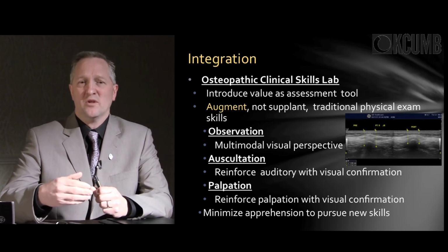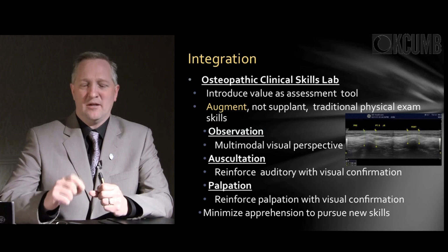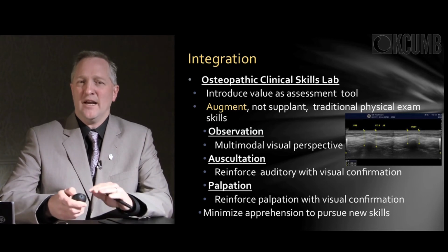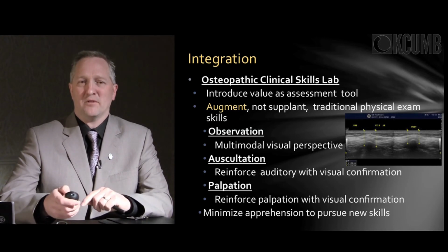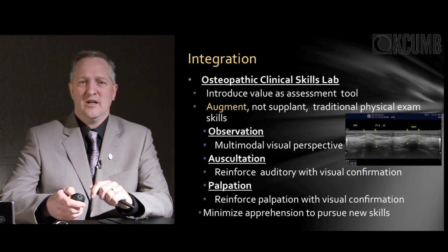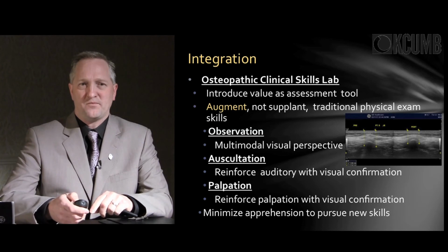When the students get visual confirmation of what they're auscultating or what they're palpating, their uptake of the information is much quicker because they get positive reinforcement, as opposed to having questions about, well, yeah, I think I feel that. In these circumstances, they can see what they're feeling, they can see that aorta pulsing. This does have a color Doppler application to it, so they can actually see the blood flow as they're feeling it. So it's a much improved ability in the lab to support our traditional osteopathic clinical skills.